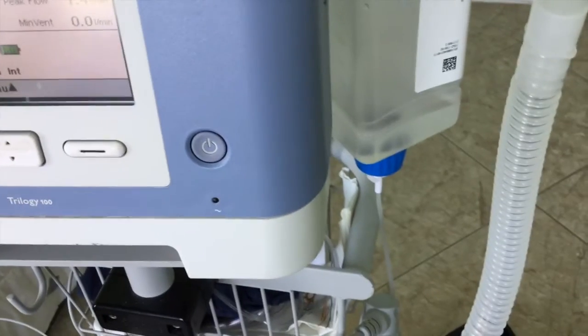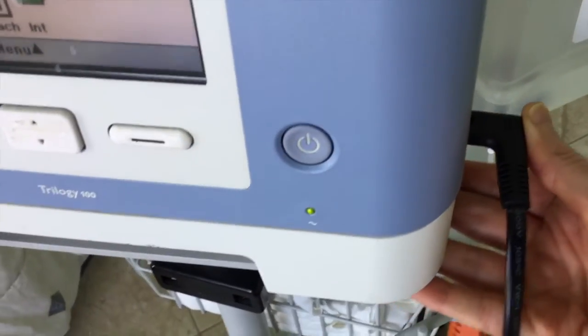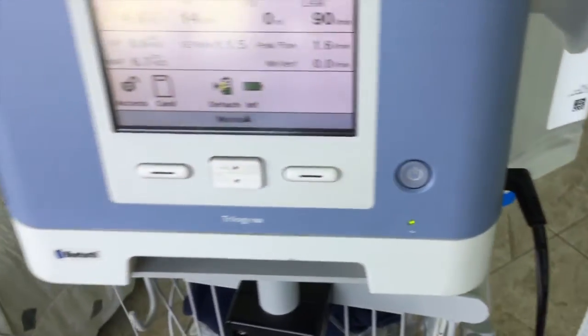After breakfast, I am very tired. I will go to bed for the rest of the morning. Mornings are very energy draining on me. I will not get out of bed again until it is time to eat lunch. Before lying down, I make sure my ventilator is plugged back into the electrical outlet and make sure my ventilator batteries are charging.